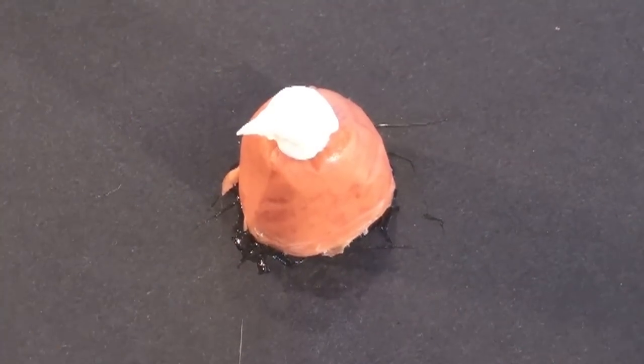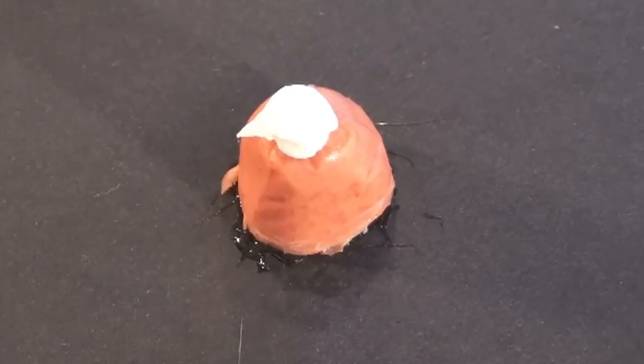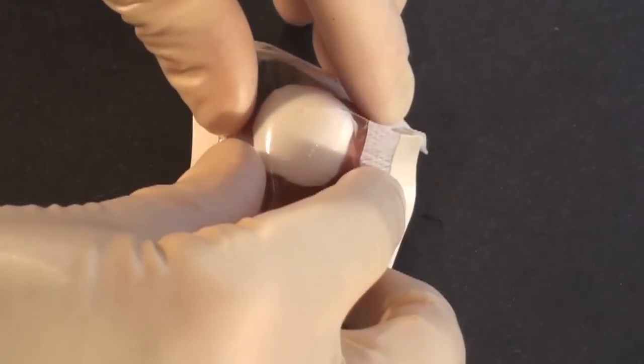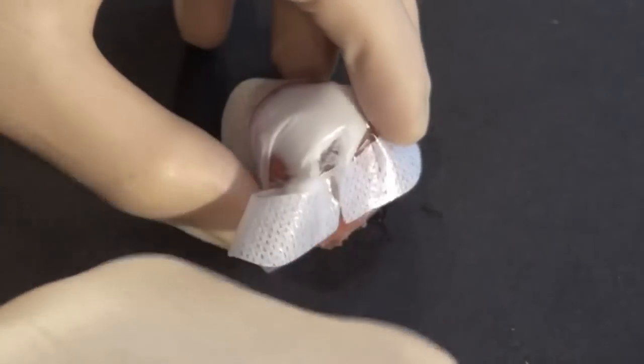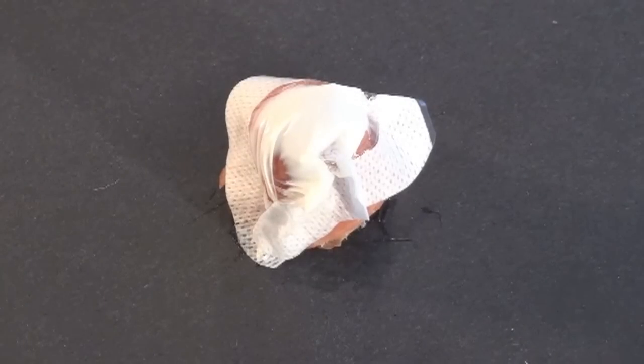Step one is to put some EMLA on top of the abscess and put a tegaderm over it. Leave it alone for a while, maybe 30 minutes. This actually doesn't waste much of your time since you don't have to stand there and watch — go do other stuff, check on your other patients, look at some labs, whatever.